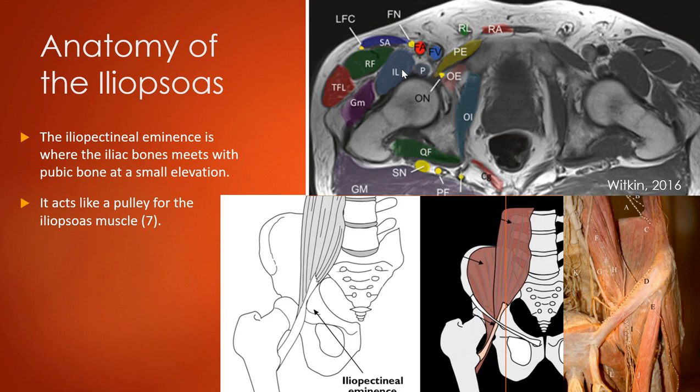When we're in transverse on the groin crease, down here, the structures we're going to see laterally are iliacus and sartorius, and in the deep part of our image we can go looking for this femoral head. It sort of looks like a rainbow. So they're good landmarks for just getting started for clicking hip.